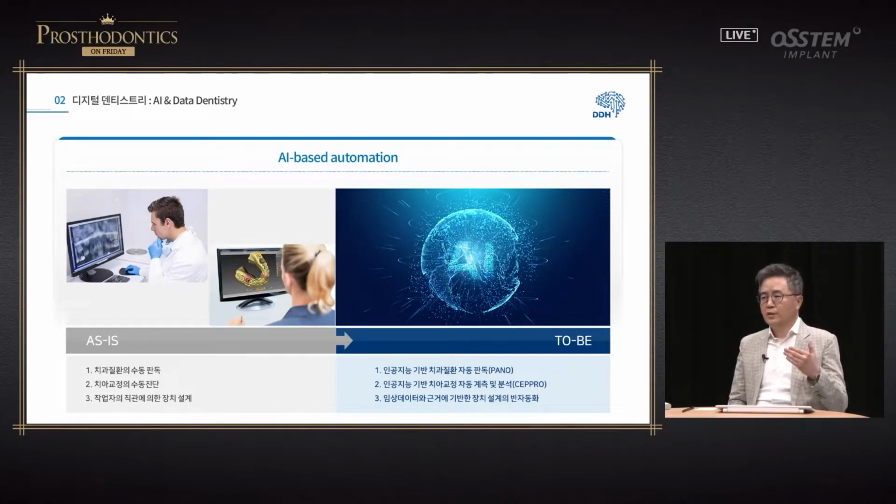currently, as mentioned, the results we get with the software or the technology vary depending on the capacity of the dentist, experience, and intuitive decisions. Therefore, the quality of the output varies significantly and is not standardized, and it's quite labor-intensive.